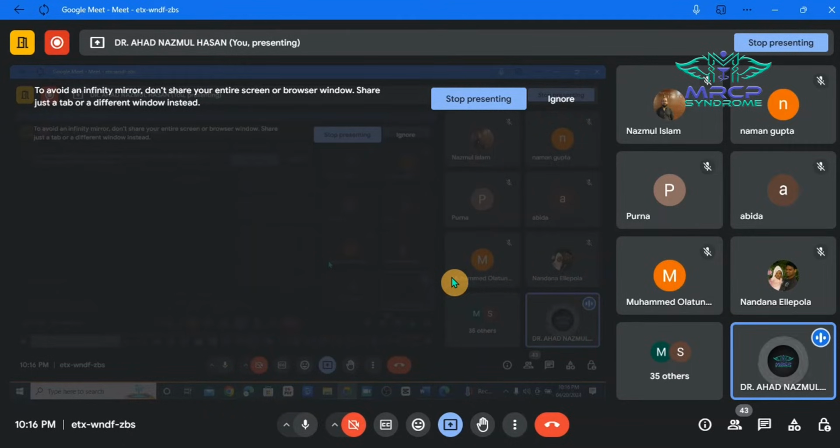And also in case of an unstable patient, an emergency patient, you cannot go for the MRI. And pregnancy is a relative contraindication. You can go for the MRI in pregnancy, but unless it is absolutely needed, usually the MRI is avoided, and CT scan is usually contraindicated. And also in case of severe agitation, or if the patient has features of claustrophobia, it is very difficult to go for the MRI. But for a patient with severe agitation or claustrophobia, we can go for anesthetic assistance, and afterwards we can go for the MRI.